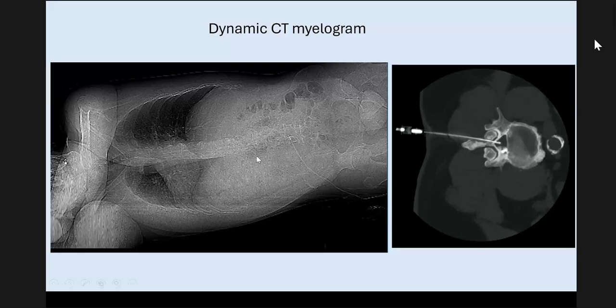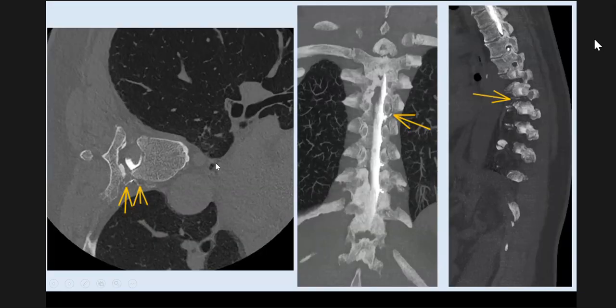doing the myelogram in the lateral decubitus position. And you can see the patient is in lateral decubitus position. We did the lumbar puncture and we injected the contrast. You can see the contrast which has collected at the redundant part of the thecal sac. And what else do we see? So see some contrast outside the thecal sac in the paravertebral region. Okay, and it's filling up the paravertebral veins. So there is enhancement of the paraspinal veins.